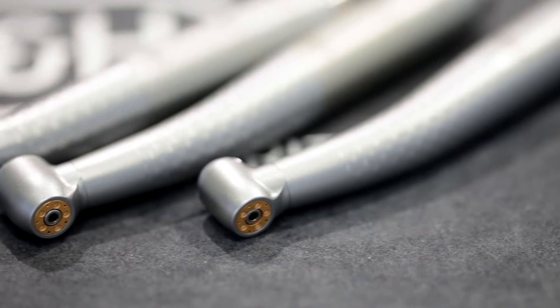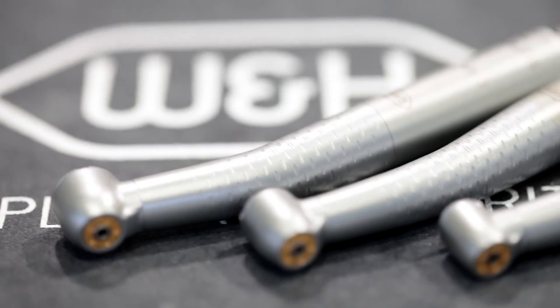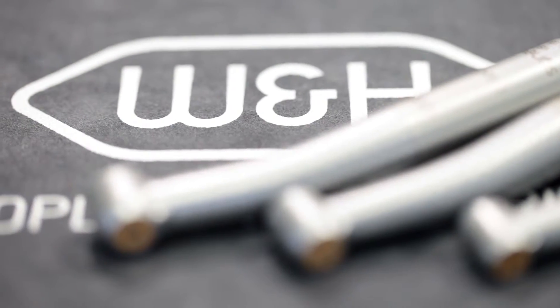Conventional dental turbines usually have a glass rod which directs the light to the treatment site. W&H has introduced an innovation to its range, giving users the option of having several light sources positioned around the burr.